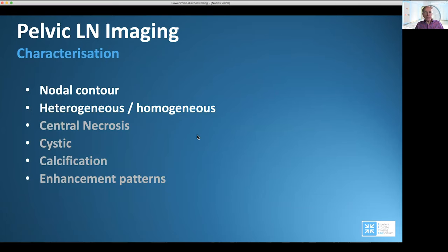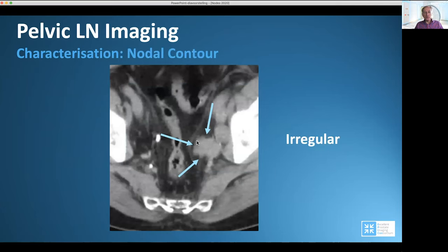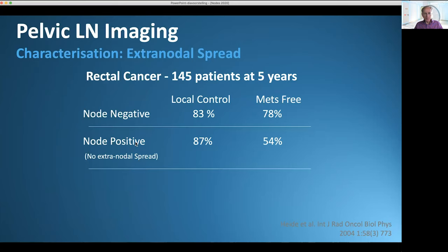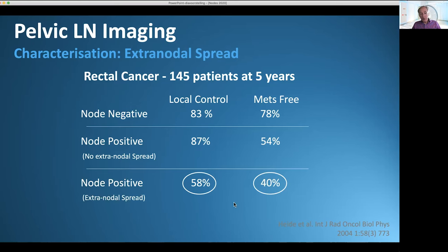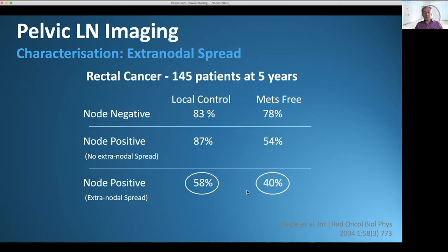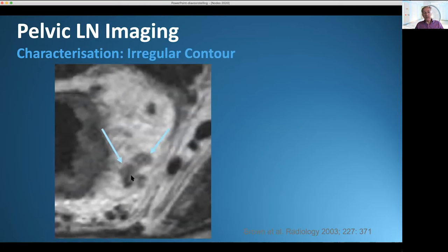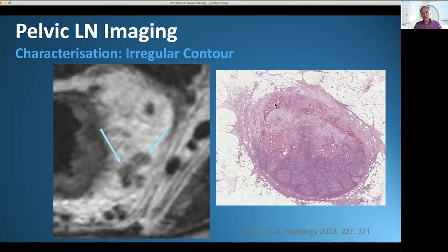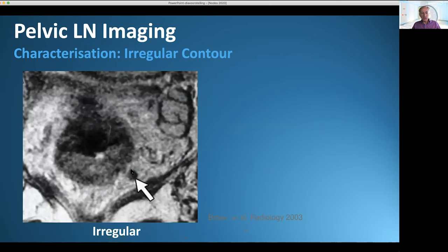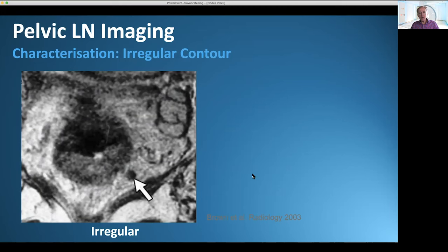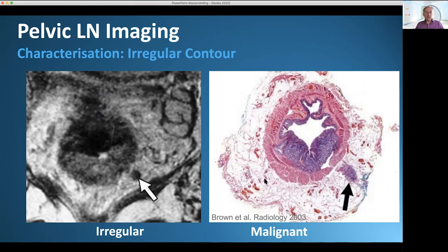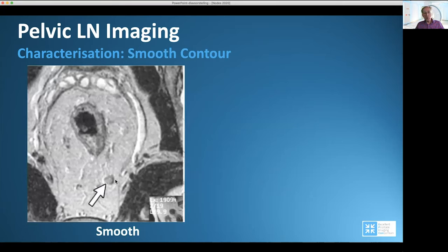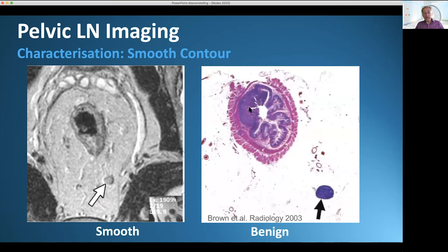Nodal contour and homogeneity are important. If you have an irregular contour, the chance of being metastatic is very high. If there is no extra-nodal spread, local control and metastatic-free survival are quite acceptable — but this decreases enormously when there is extra-nodal spread, making it a very important prognostic factor. You can see an irregular lymph node with extra-nodal disease, confirmed on histopathology. A slightly irregular, inhomogeneous lymph node also has a very bad prognosis.